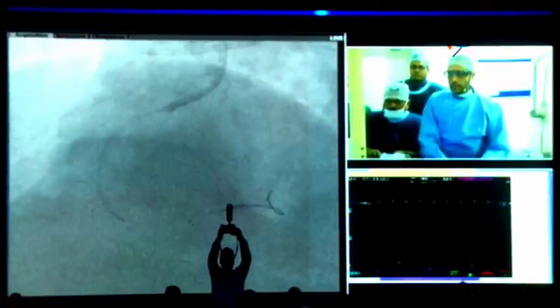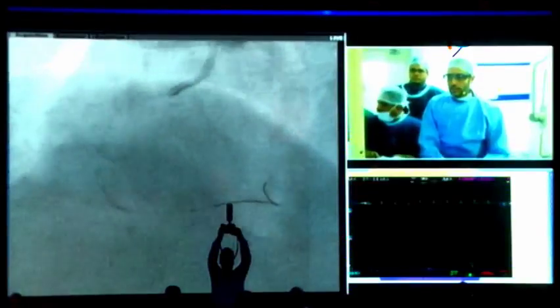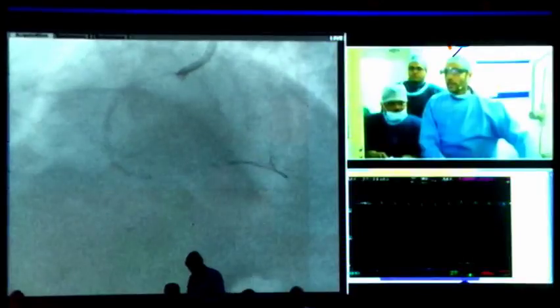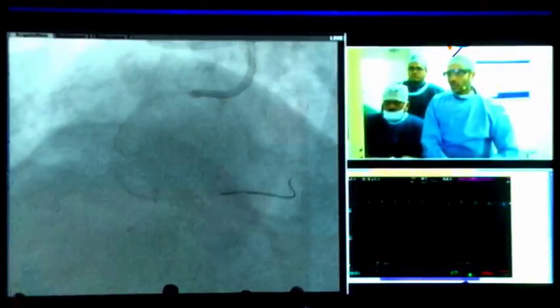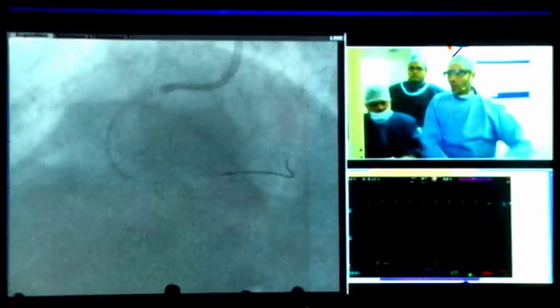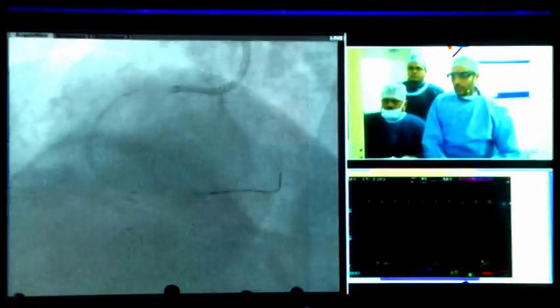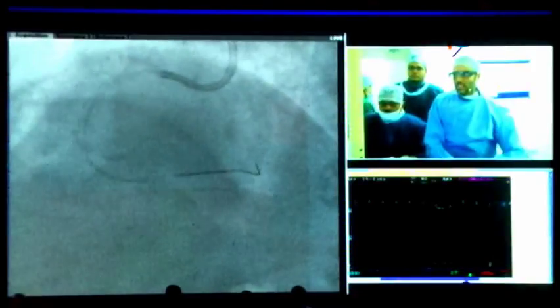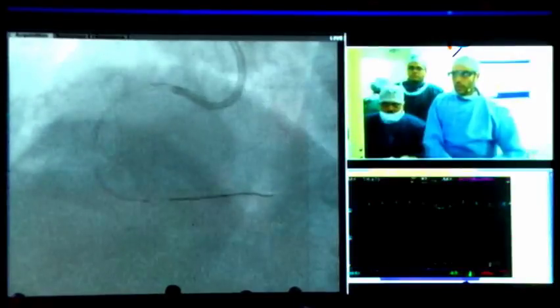Okay, as somebody very astutely said, it's not going. Okay, come closer. So give us a balloon. I expected it to go till where you bossed it. Yeah, me too. I was kind of hoping, but if it doesn't, it doesn't. Okay, whatever. It's fine. We'll balloon it. It's going. I just got to be patient with it. It's going somewhere. So I'll go as far as it goes.